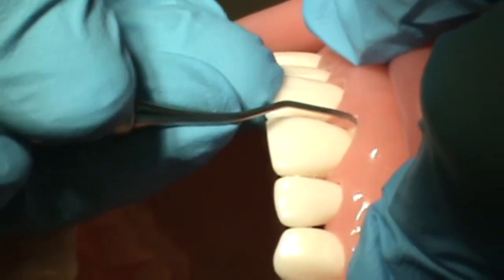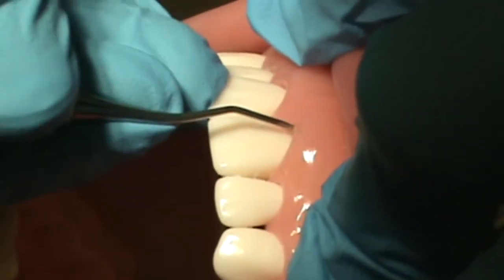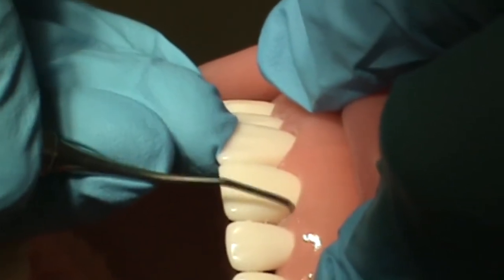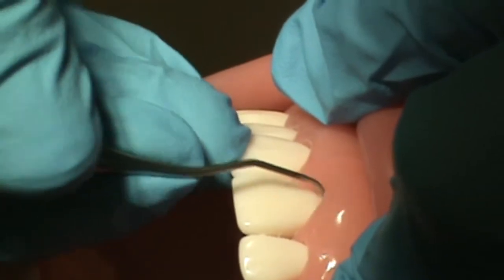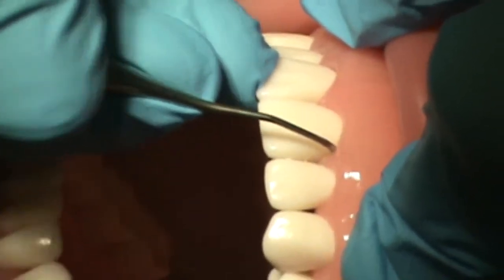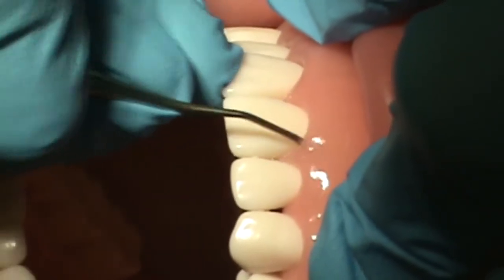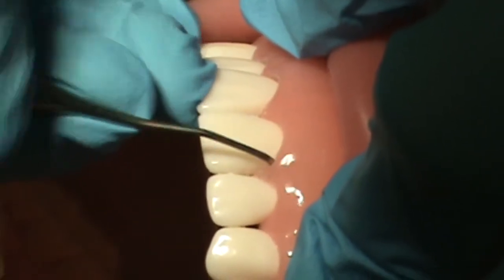controlled, overlapping strokes along the root, never removing the instrument from the pocket, but keeping the cutting edge in contact with the tooth at all times. She rolls the handle along the distal facial line angle as she root planes along the facial towards the distal, utilizing a wrist rock technique. She root planes into the interproximal and under the distal contact, applying appropriate lateral pressure the entire time.